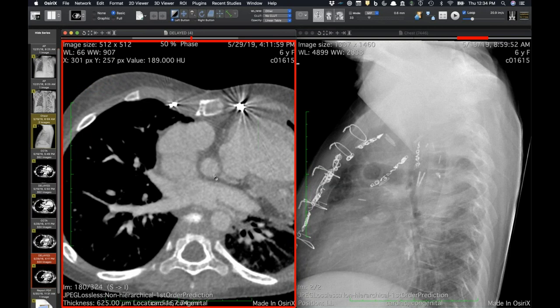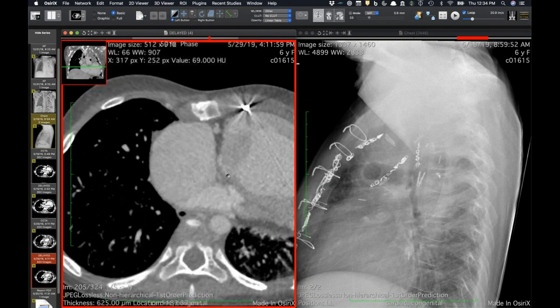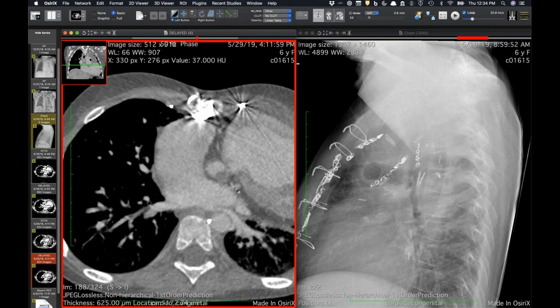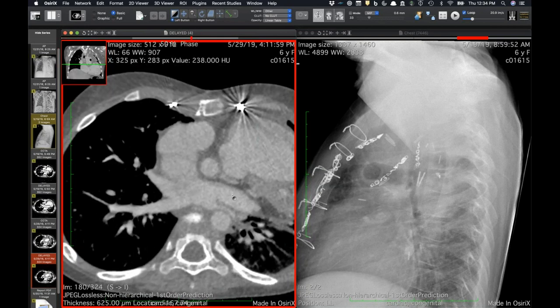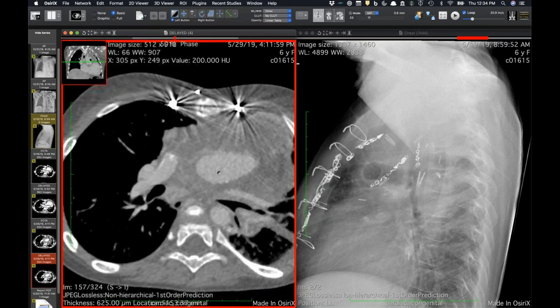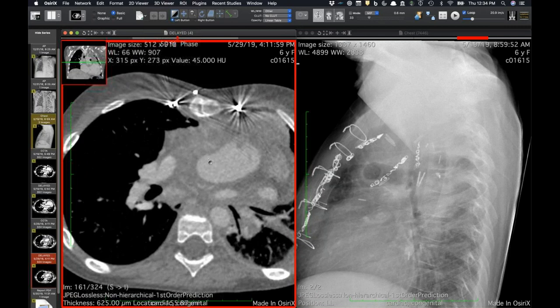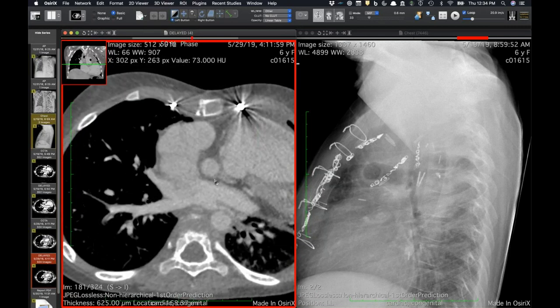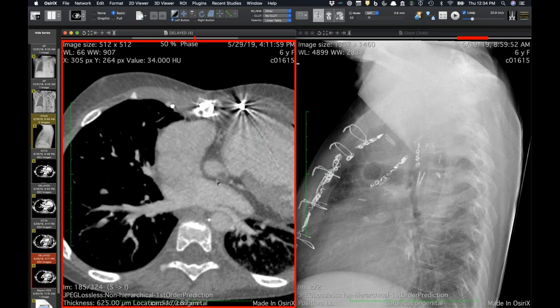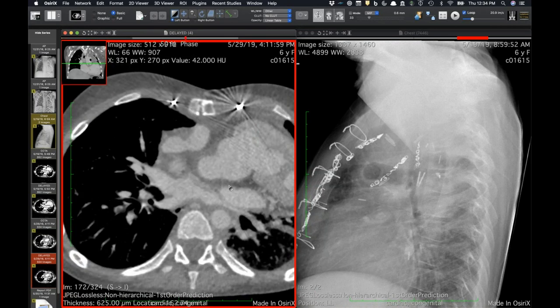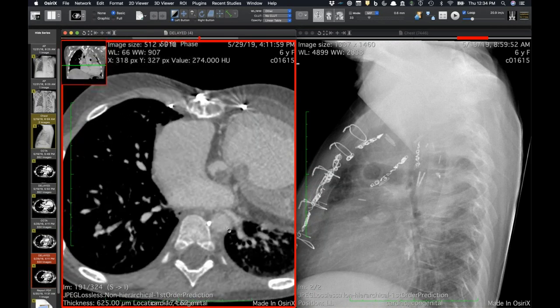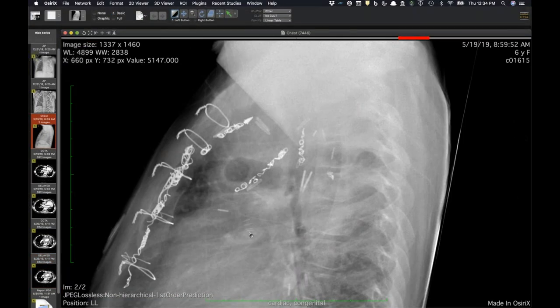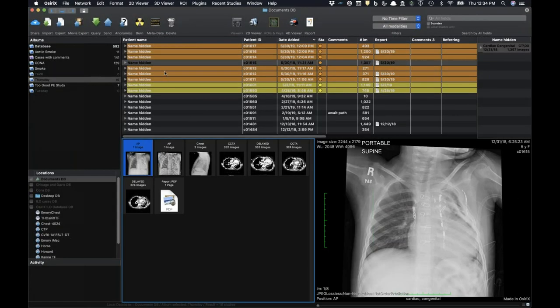She has new thrombus along the aorta extending to her left coronary artery ostium, and the pseudoaneurysm continues to enlarge with more infection. I've never seen this before as a complication of congenital heart disease surgery - air just replacing the entire left pulmonary artery graft. The infection precludes doing a transplant. She has a little rudimentary aorta that fills the coronary arteries, and the anastomosis to the rest of her arch is a Damus-Kaye-Stansel - that's the portion of the surgery when you have a rudimentary aorta, so you retrogradely perfuse the coronaries. Rather a crazy case.